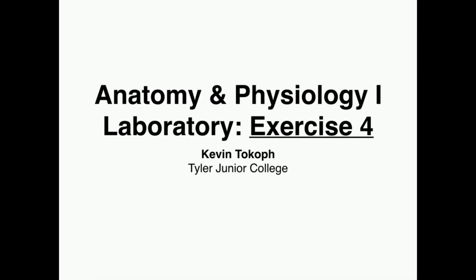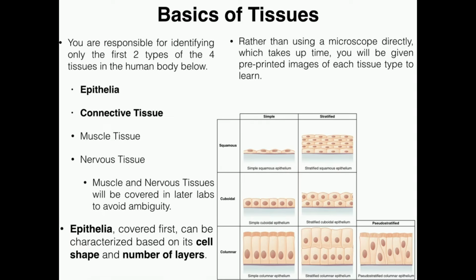I'm Kevin Tokoph, and in this video we're going to go over key concepts from exercise 4, which pretty much is histology. Histology is defined as the study of tissues, and for the most part we're going to be looking at microscope slides, or images of these tissues on microscope slides. All right, so let's go into some of the basics.